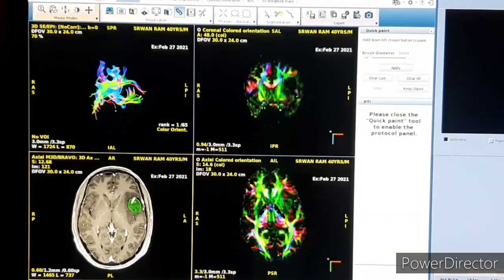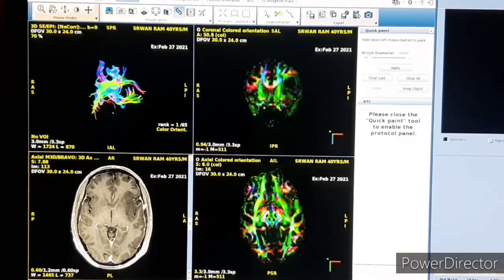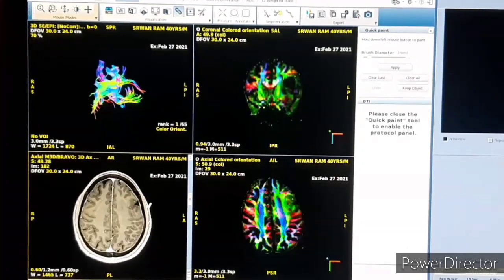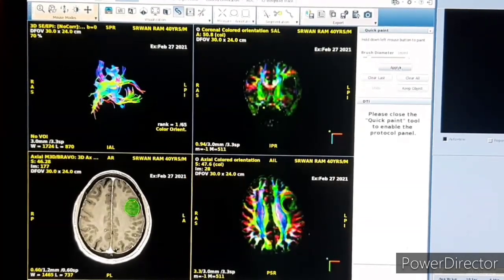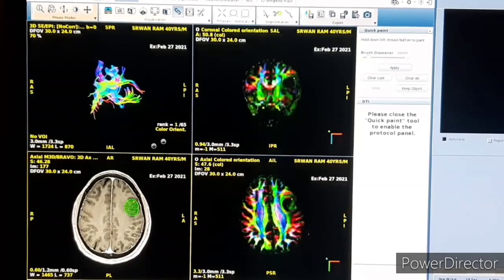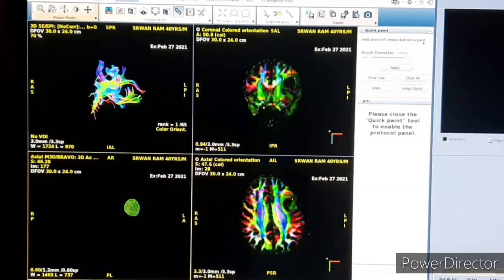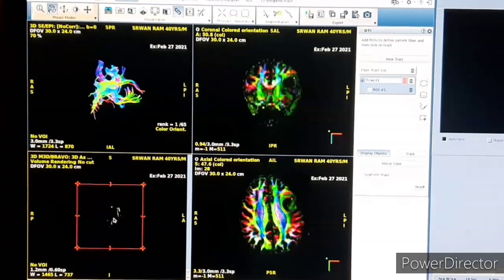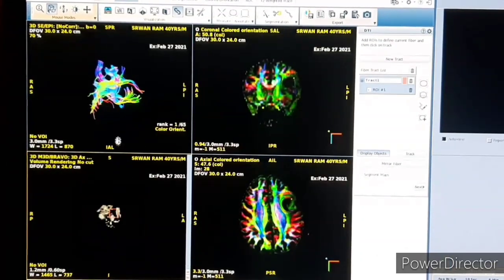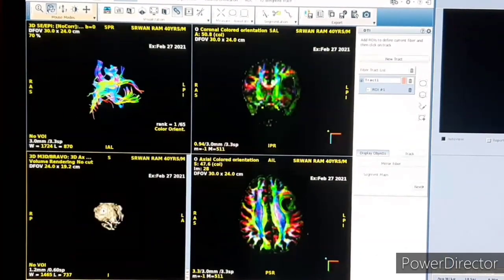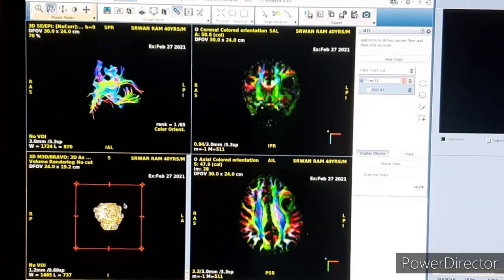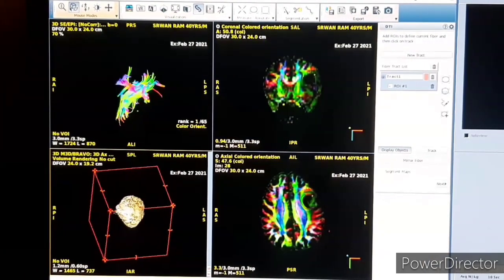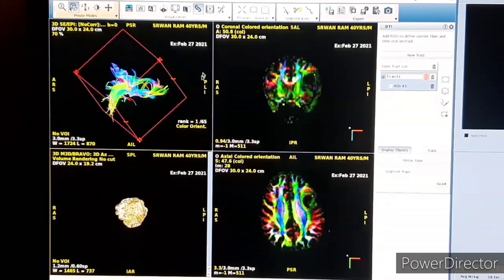Now we will go to Apply. When we apply, only the traced part of the tumor will remain, and the other parts of the brain will go out. After applying, we get the traced area of the tumor. Then we go to 3D and just adjust the contrast — you can see the tumor now.